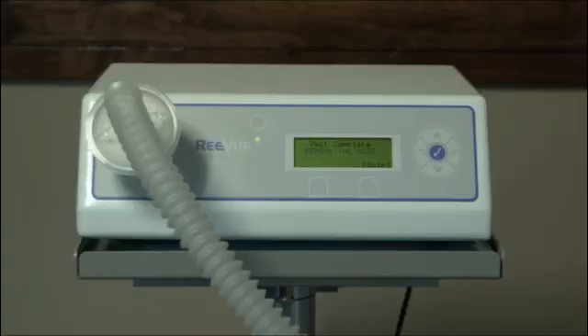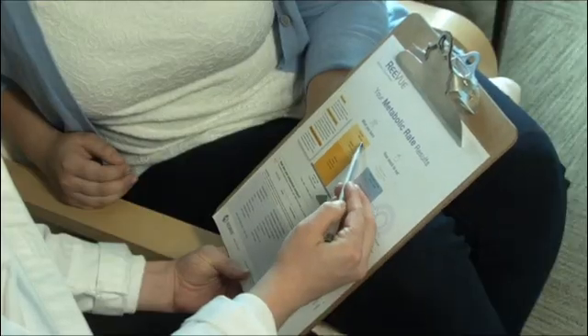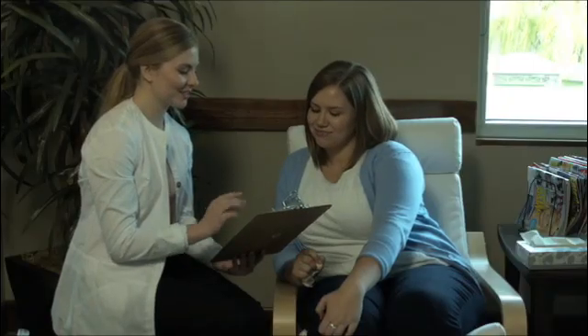When the test is complete, the ReeVue will beep. You simply dispose of the metabreather mouthpiece, enter in some basic data, and the results are ready to print. You will then be able to customize your patient's calorie goal depending on where they are in the weight loss process. That's metabolic testing with the ReeVue — it's quick, easy, and anybody in the office can do it. Thank you.